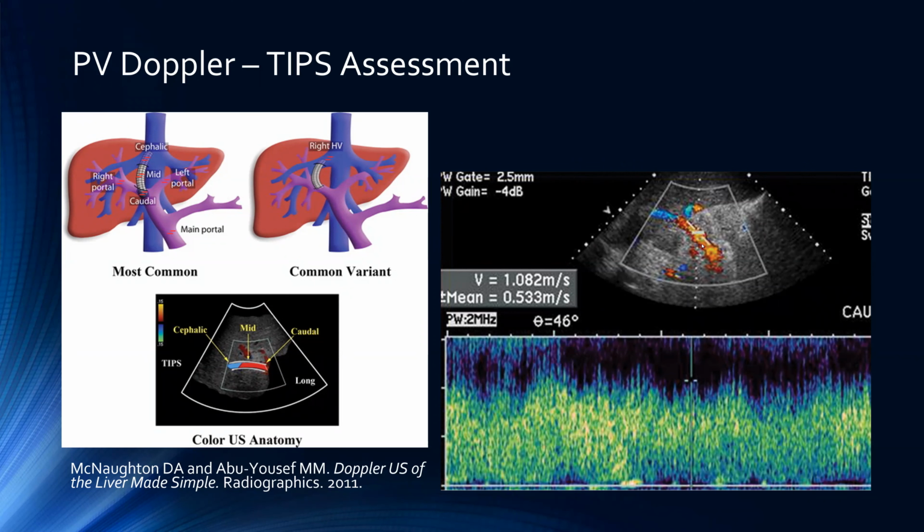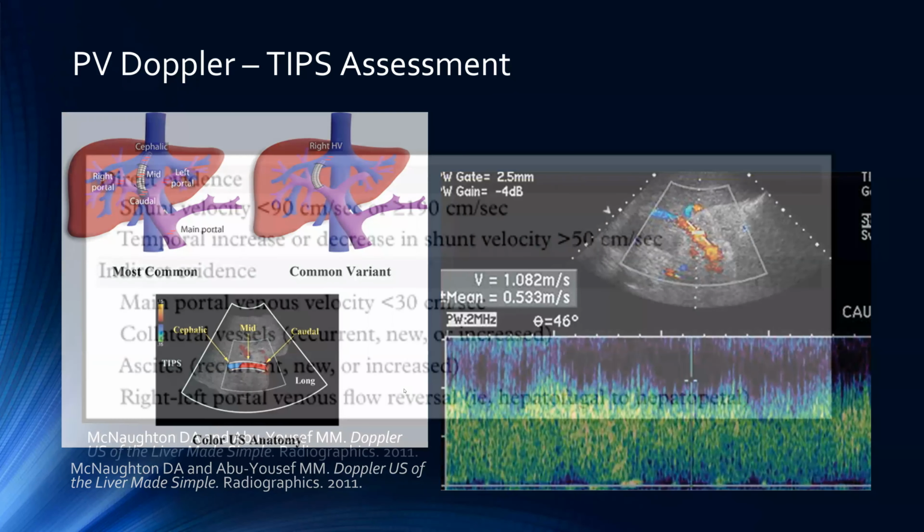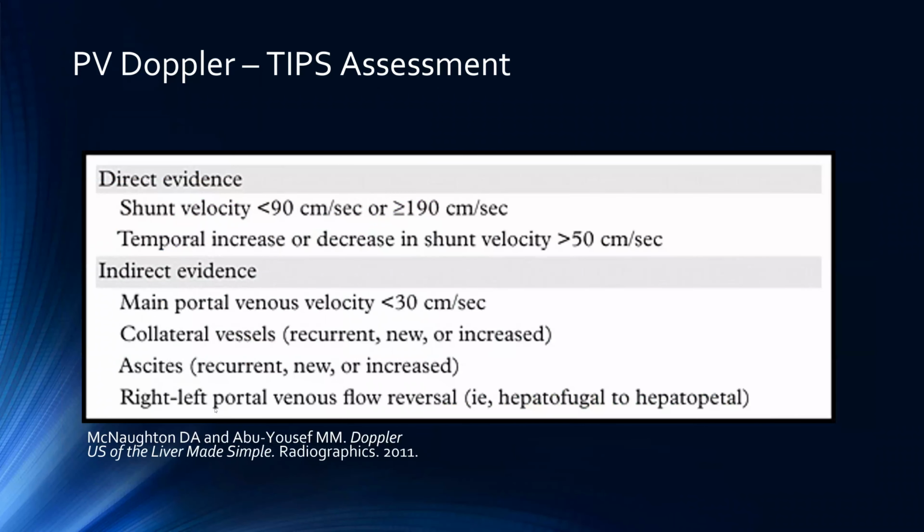So here you can see within the main portal vein, you're having that antegrade flow. Generally, what you're going to be seeing. So really and truly, the flow directions and velocities for these cases, from the radiologist's perspective, need to be interpreted in the context of prior examinations and are far more ambiguous when taken in isolation. That being said, there's certainly some findings that can be seen in isolation that would suggest shunt failure, and these are what we're really looking for with these exams.